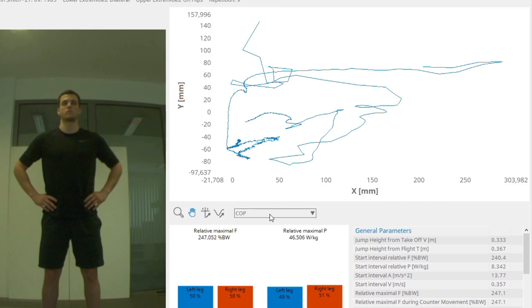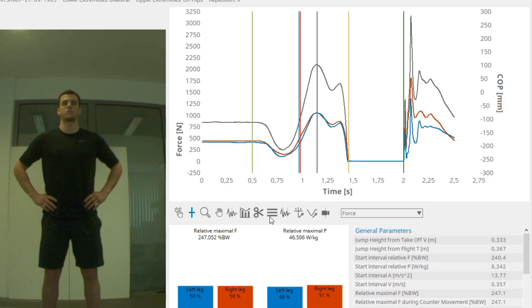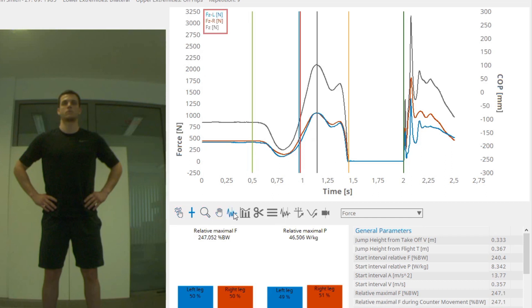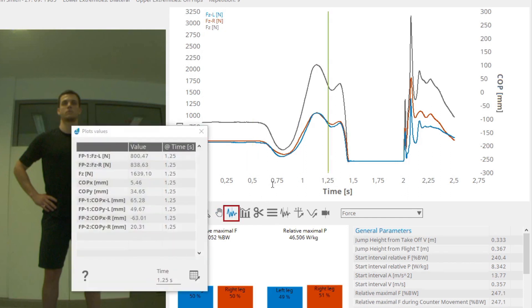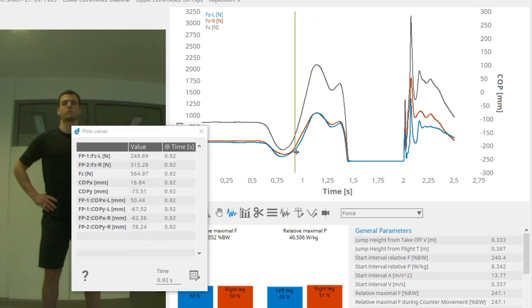There are some toolbox functions that help the user to easily manipulate data. Note that scissoring the data is not reversible. By clicking on the Legend button you will get a legend on the graph that shows which color represents which signal. Plot Values will show you the values for each plot on the graph at the cursor position.